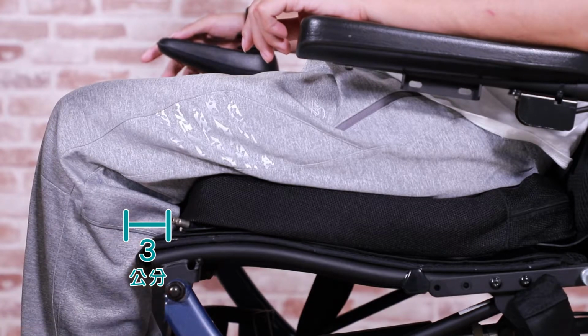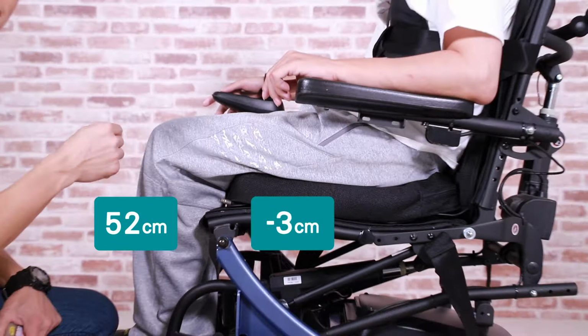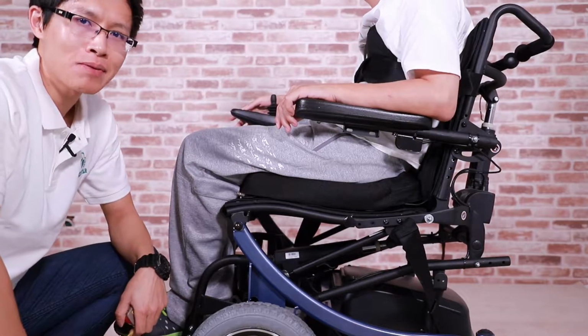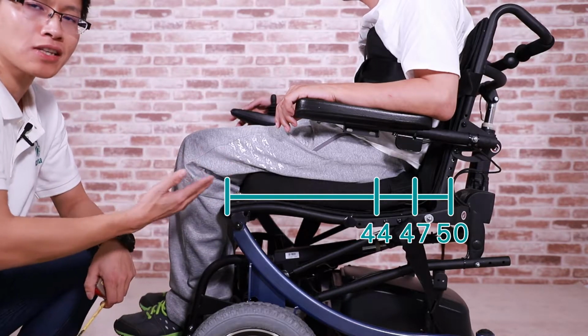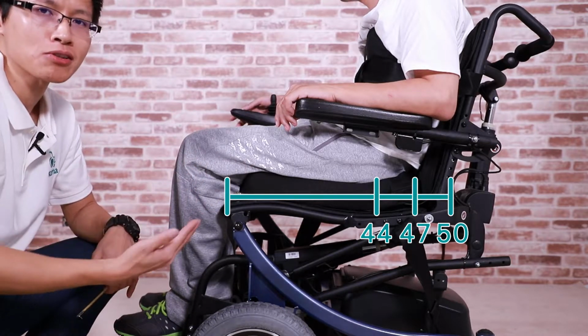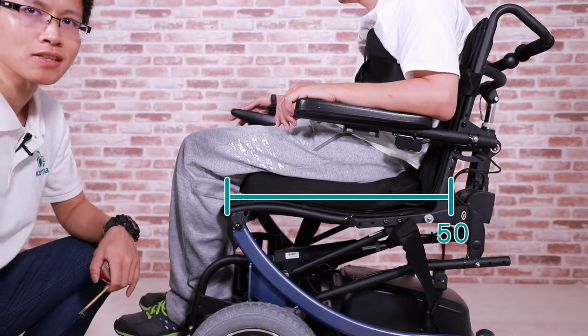Now, Mr. Zhang's thigh length is 52 centimeters. Minus the 3 centimeters gives us 49 centimeters. The seat depth can be adjusted to 44, 47, and 50 centimeters. Based on what we've measured, Mr. Zhang's thigh is 52 centimeters. Minus the 3 centimeters gives us a number that is close to 50 centimeters.